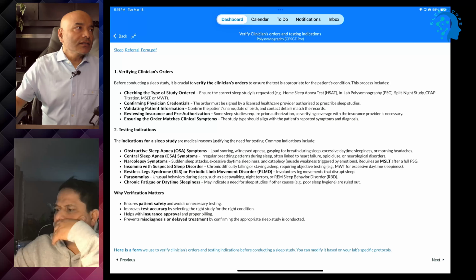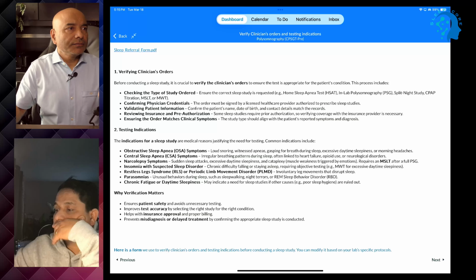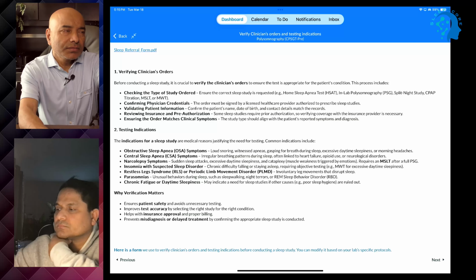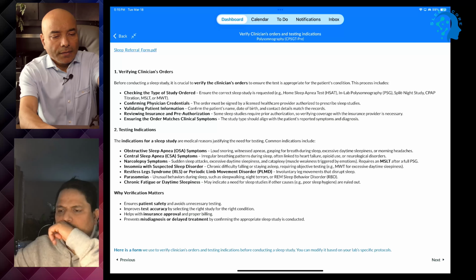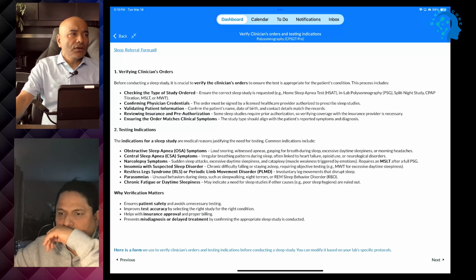All right, let me see. There are many companies, but 2 big ones, ResMed and Respironics. They have different types of home sleep study devices. Let me show you one home sleep study.